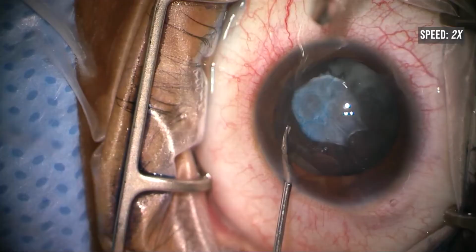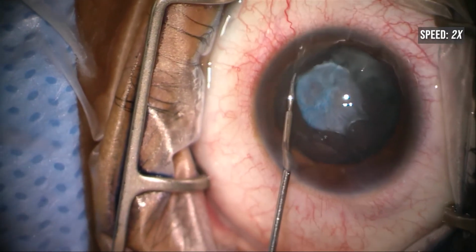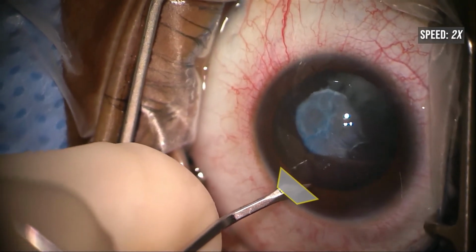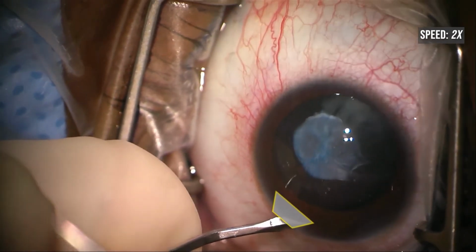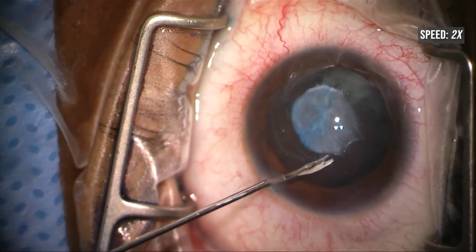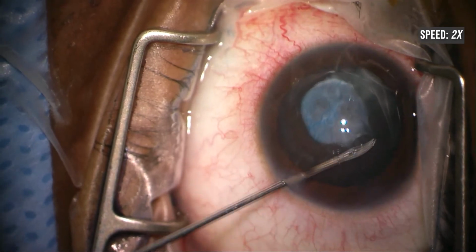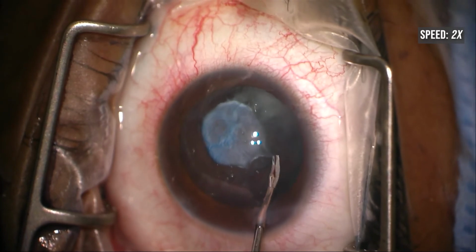So we're going to continue to run it around in a clockwise fashion, getting over past the 6 o'clock meridian and a little bit around to the infero-nasal section. Now I'm going to widen the wound and make it somewhat trapezoidal so that I can run the scissors down in this direction. If I didn't widen it along those directions, it would be hard to advance the scissors in because it would be binding inside that incision.